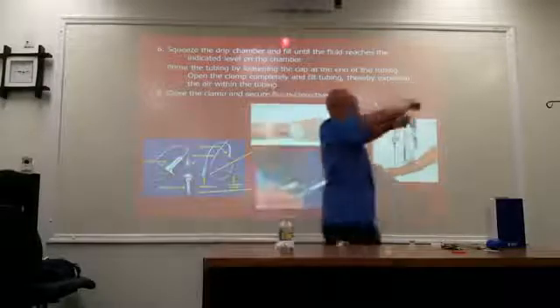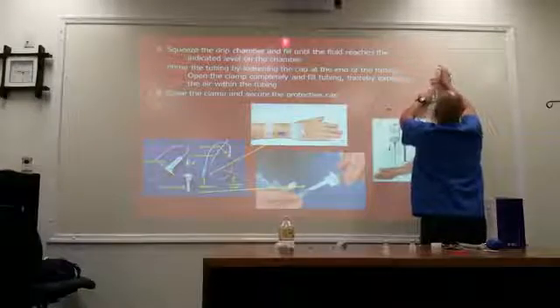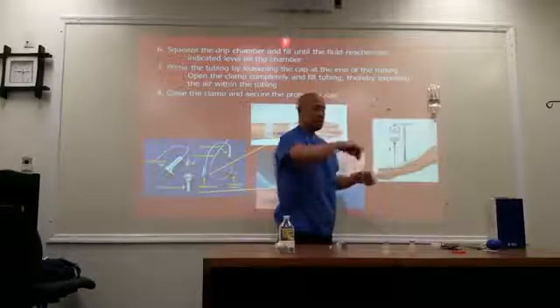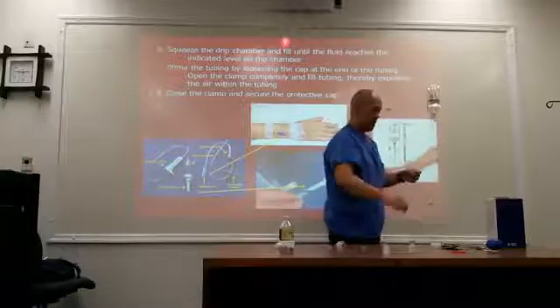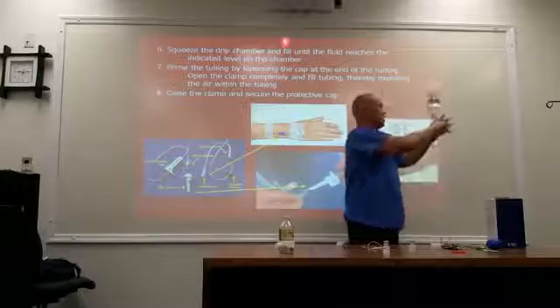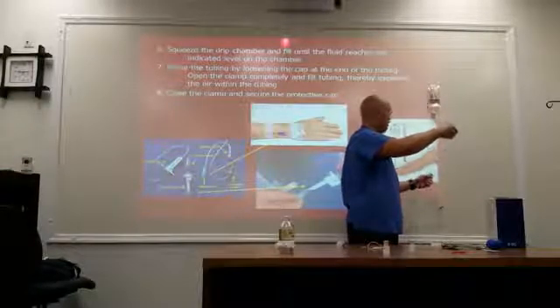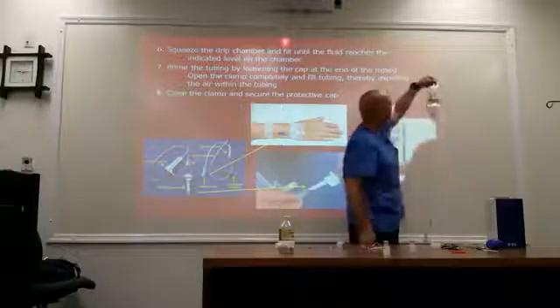All right, so I have a pole here, but I'm going to put it right here so you guys can see it better. So we need to get rid of the air. To get rid of the air, I'm going to let this run a little bit. So I'm going to unclamp it. There's a couple places here to unclamp. There. See how it's dripping?